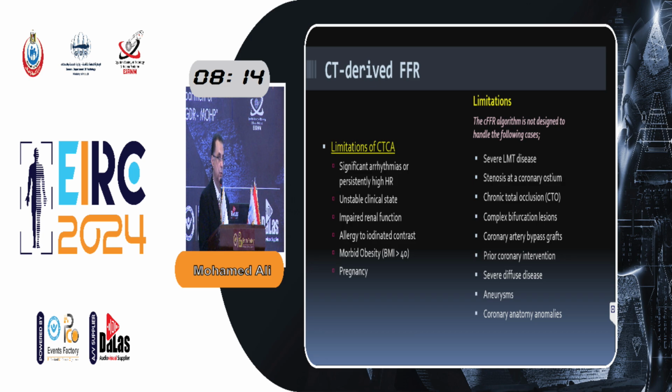Regarding the first 2 points, there will not be a reference to correlate the flow distal and proximal to the site of the lesion. Also, in cases of chronic total occlusion, there is no need for FFR, there is flow limitation definitely.